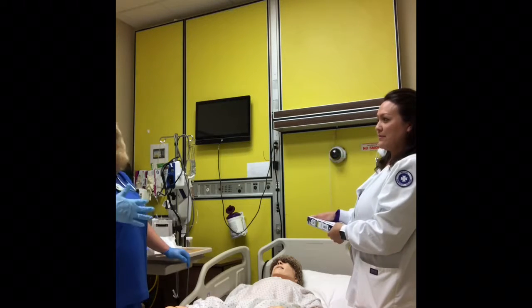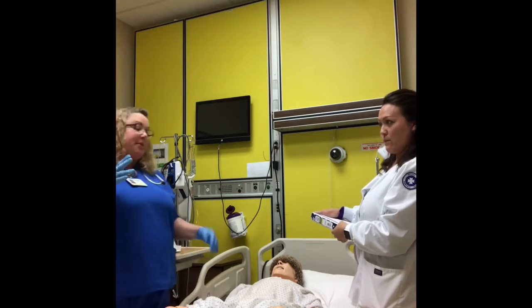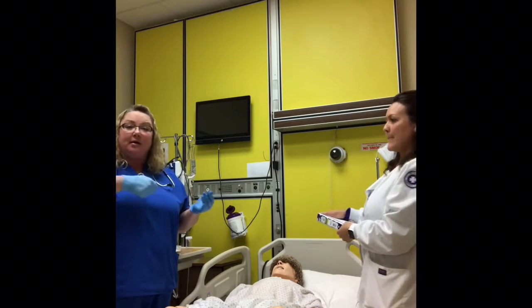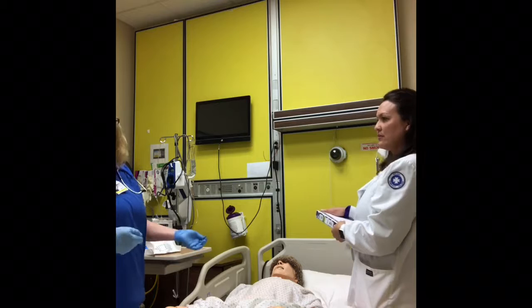Okay, and then for removing the Foley, it's basically the simplest thing that you can do. You just explain that it's not going to hurt. You can tell the patient to take a breath when you remove the tube, but make sure you enter the room with your syringe. I would recommend a syringe above 10 cc's to take it out, because if you get a 50 cc syringe or maybe even a 30 cc syringe, you take the water out, and you've got your 10, and then you meet resistance, you know it's all done.